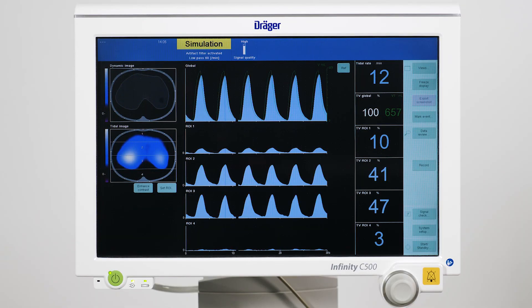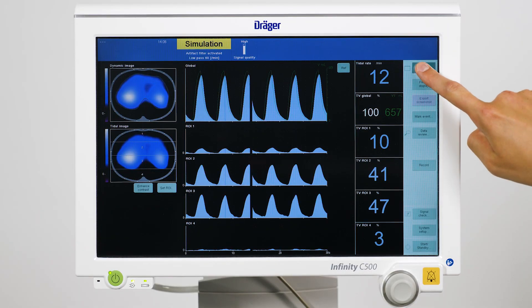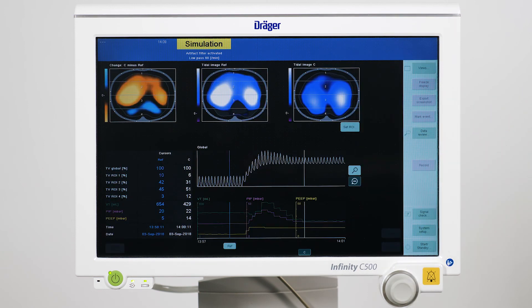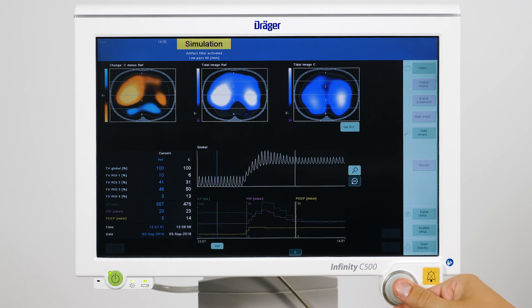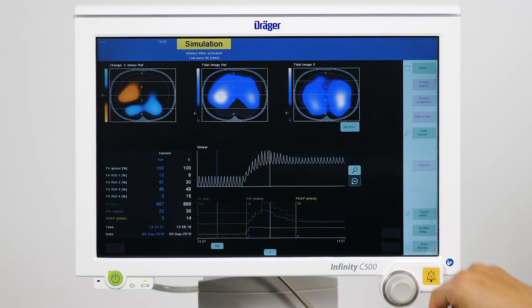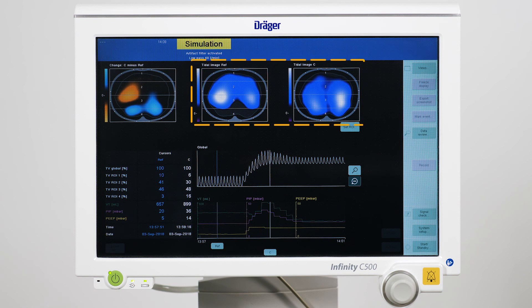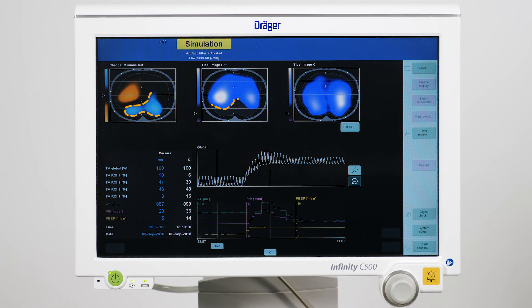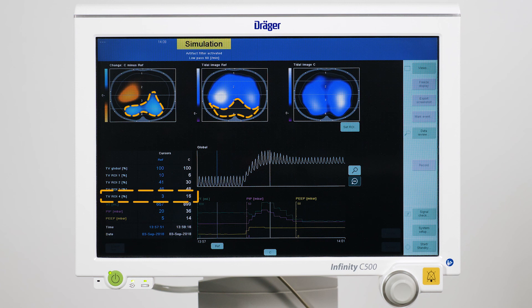Now we have to identify whether the patient is a responder or a non-responder to the recruitment maneuver. We can directly assess this with the help of the end-inspiratory trend view of POMOVISTA. I am placing the reference cursor before the recruitment maneuver and the comparison cursor right in the middle of the recruitment maneuver. We can see a tidal image for each cursor position. In this example, the recruitment maneuver was able to significantly improve ventilation in the dorsal part of the lung.